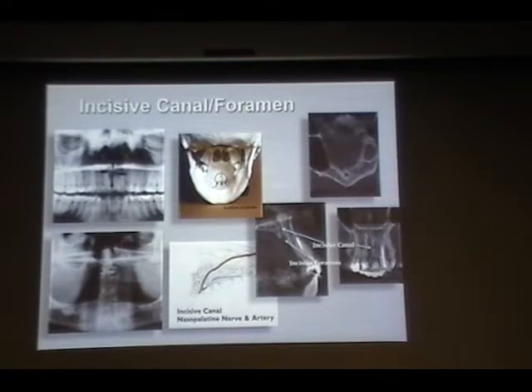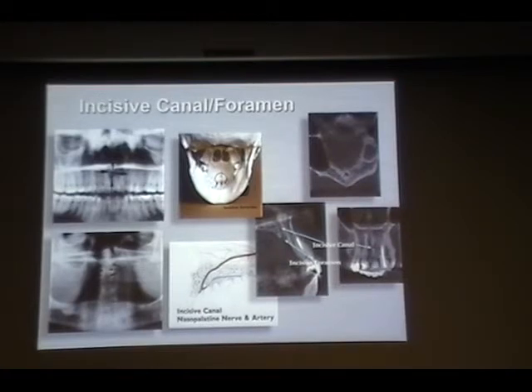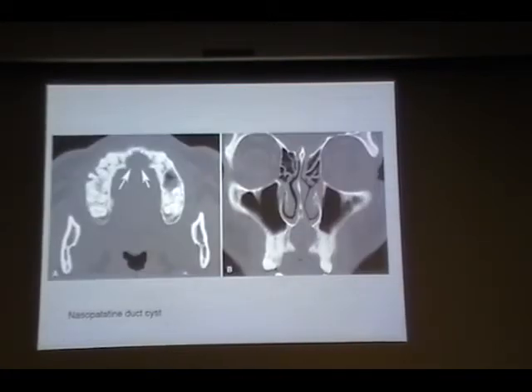Exceptions, if you have a cyst, it could be very bulky or it will cause the loss of that presentation here. I'll have the next slide to show you an example. Like here.